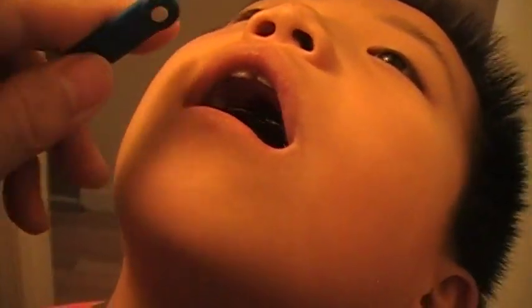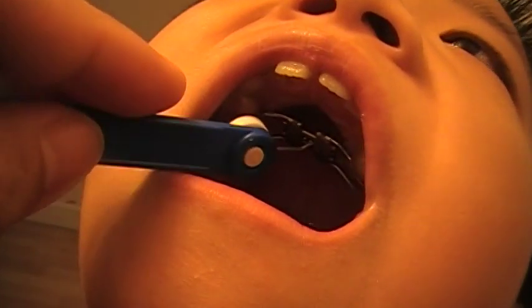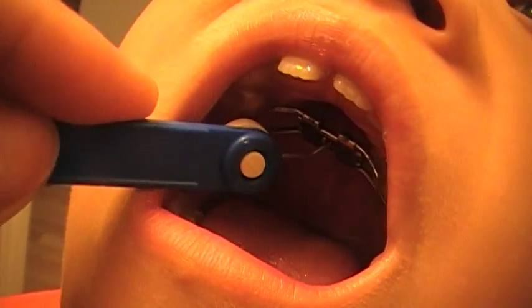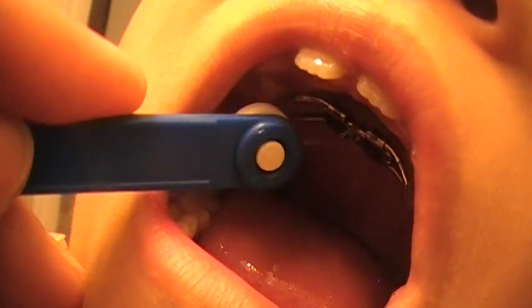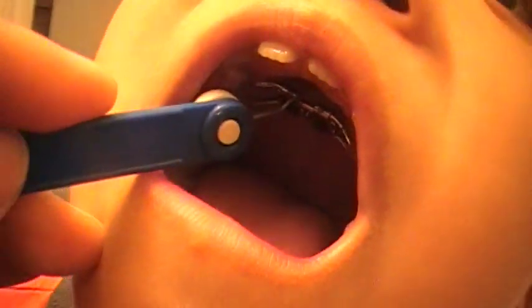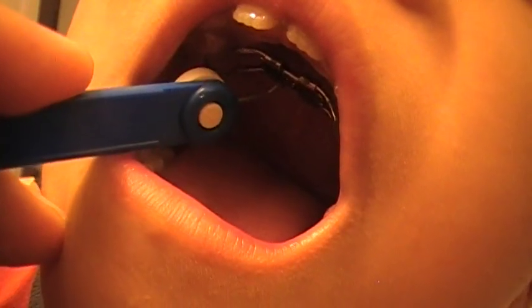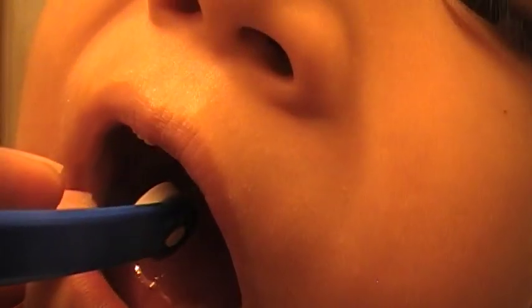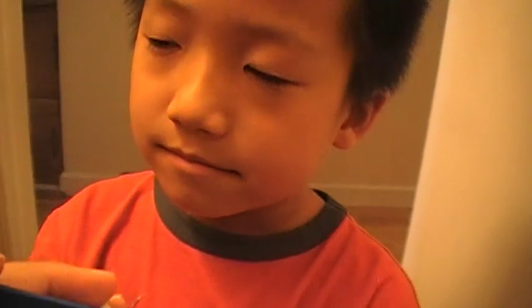James, come closer. Open your mouth, please — tilt really high. Find where there's a little hole in there. After you put the key in the hole, you turn it all the way — push it all the way in so that it will turn. Good, so that's done.